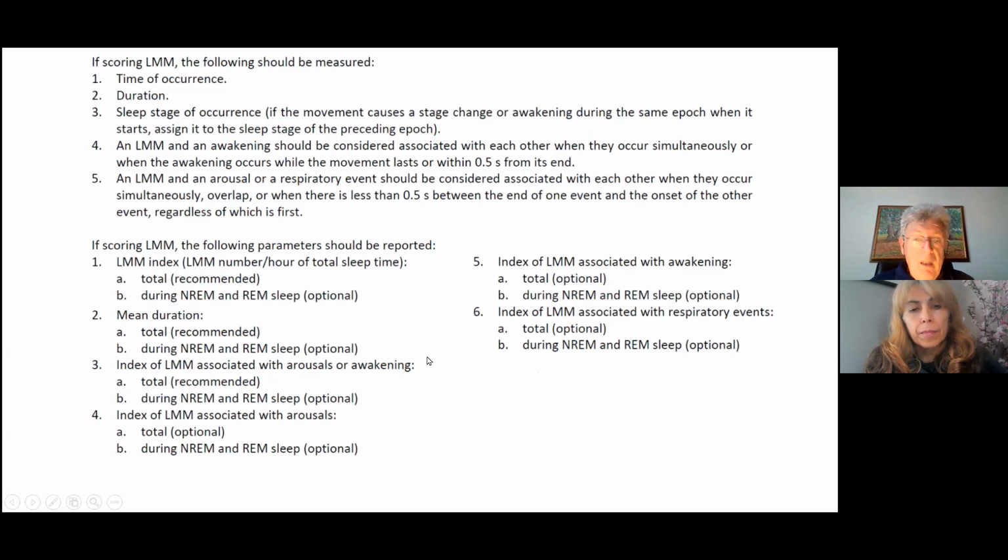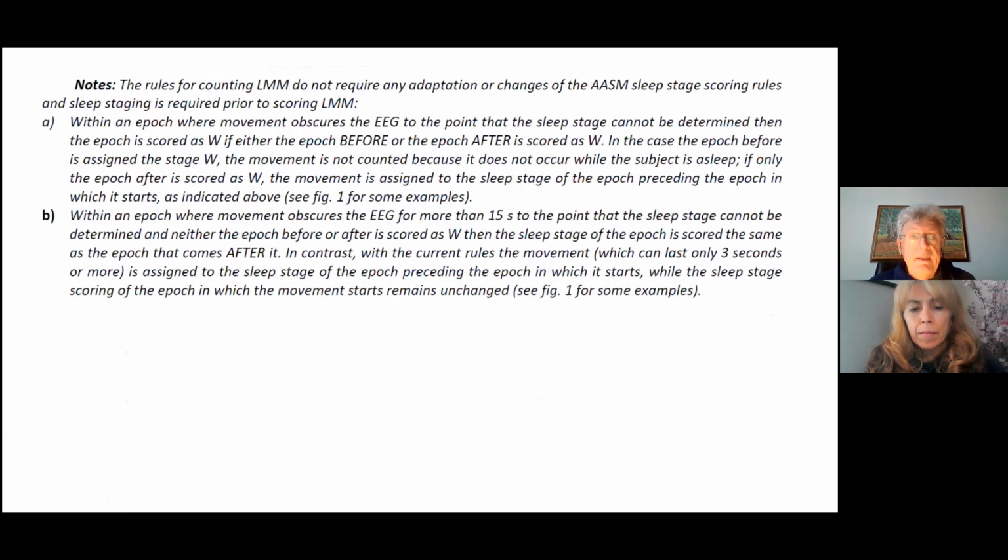As you can see, these are recommended until this point here. From point 4 on, they are all optional, but they are much more detailed. The notes are very important. Notes are called notes, but sometimes they are more important than the rules. It is important to notice this, that the rules for counting LMM do not require any adaptation or changes of the sleep stage scoring rules, and sleep staging is required prior to scoring LMM.